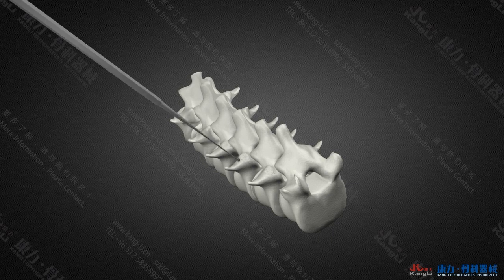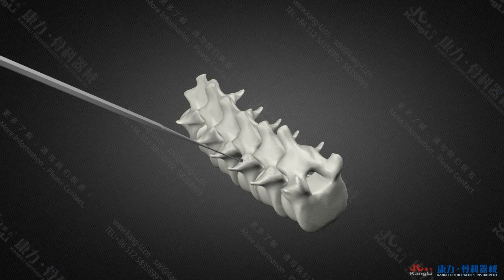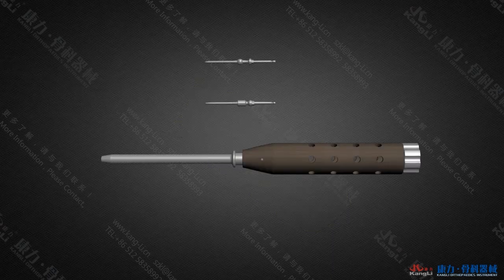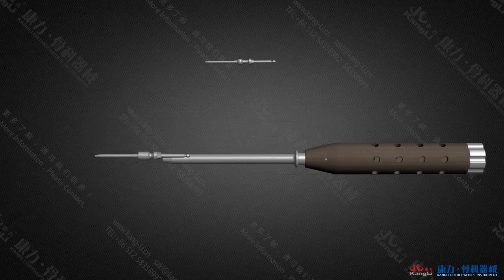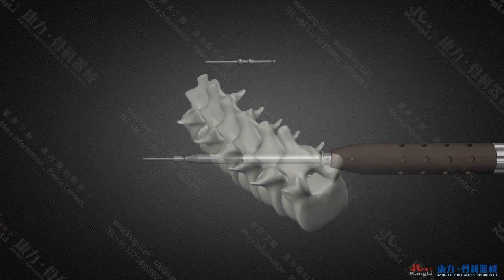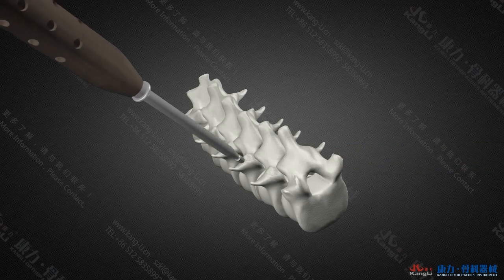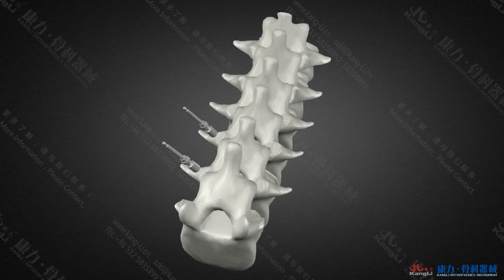After that, use the probe to detect the implantation hole. Finally, use the developing needle implanter to insert the developing needle. Repeat the above to make the other 5 implantation holes and insert the developing needles.